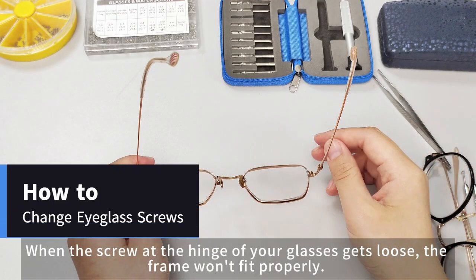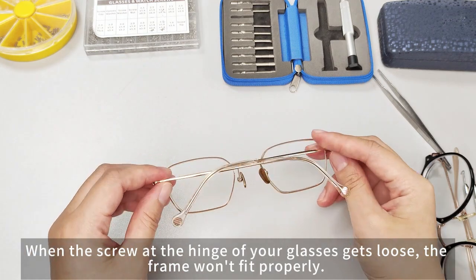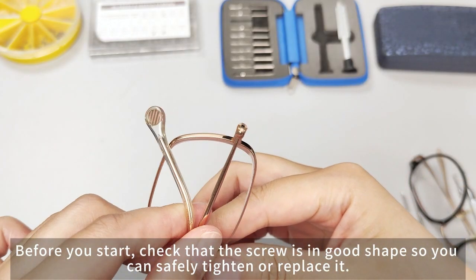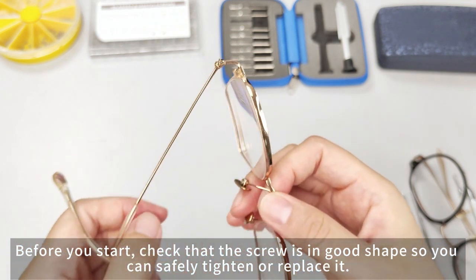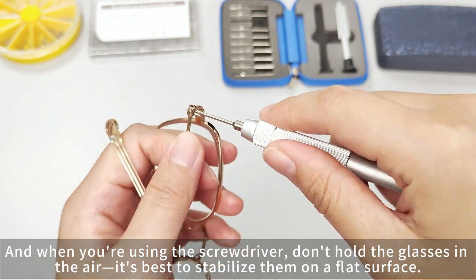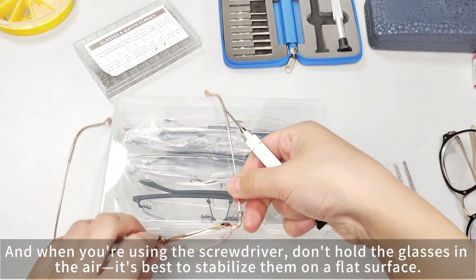When the screw at the hinge of your glasses gets loose, the frame won't fit properly. We need to tighten that screw with a screwdriver. Before you start, check that the screw is in good shape so you can safely tighten and replace it. And when you are using the screwdriver, don't hold the glasses in the air. It's best to stabilize them on a flat surface.